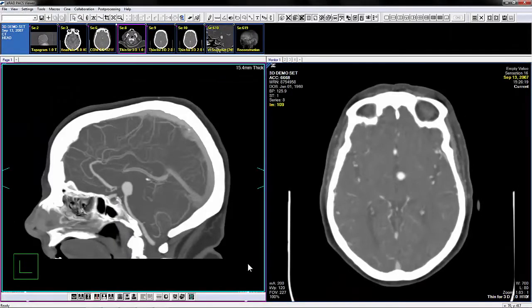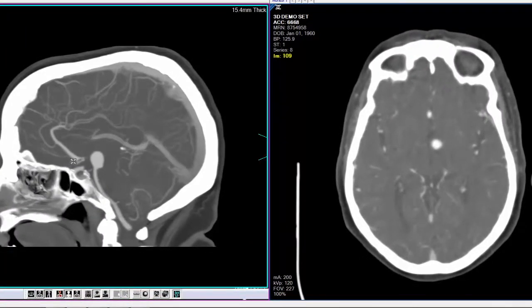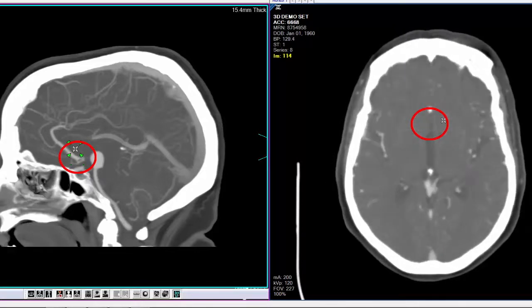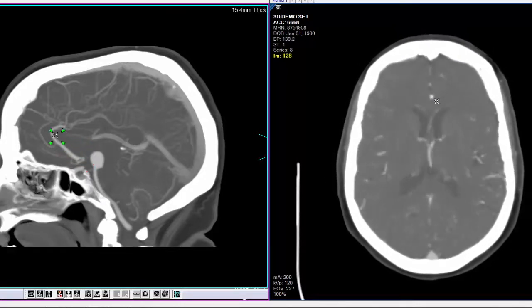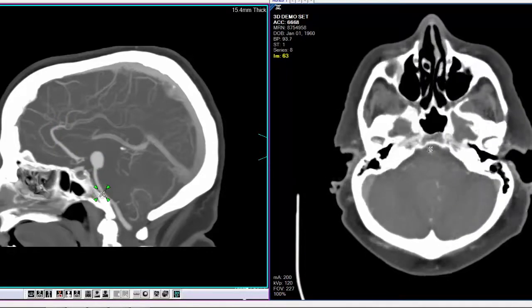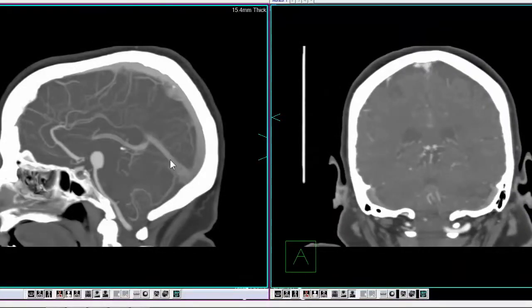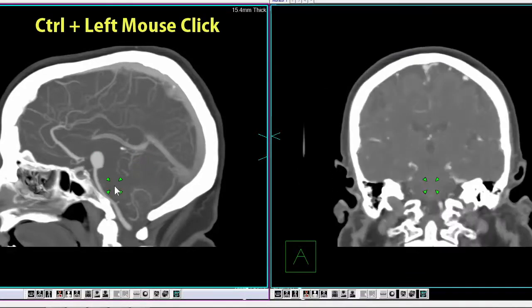Magic X is a cross-correlation tool that identifies the same point in all orthogonal images and volumes. To enable the Magic X tool, locate and select the Magic X icon from the main viewer's toolbox toolbar. Press and hold the left mouse button to triangulate a point across volumes and 2D datasets. Drag the mouse while holding the left-click button to dynamically triangulate a point of reference. When multiple volumes exist, a quick triangulation can be achieved by holding Ctrl and doing a left mouse click.